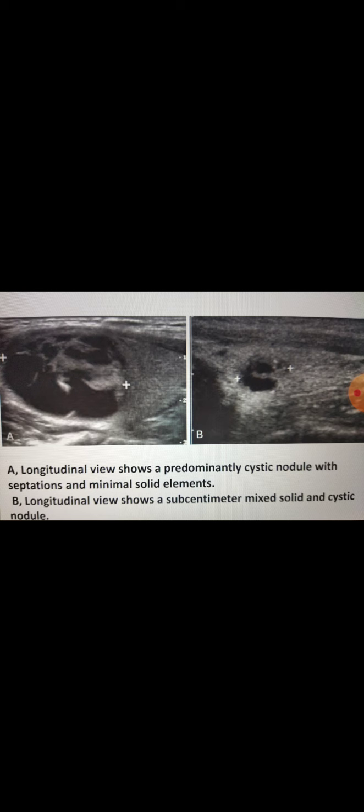And this longitudinal view is showing the cystic nodule with septations and minimal solid elements, and this is basically a papillary cancer. So the minority cases can have cystic changes in papillary cancers as well.